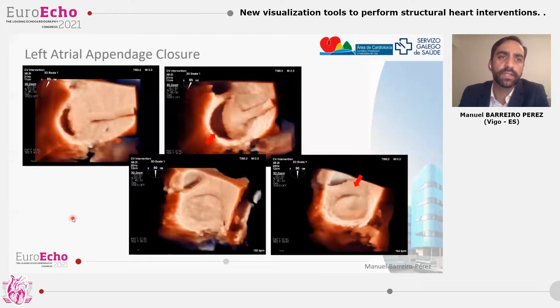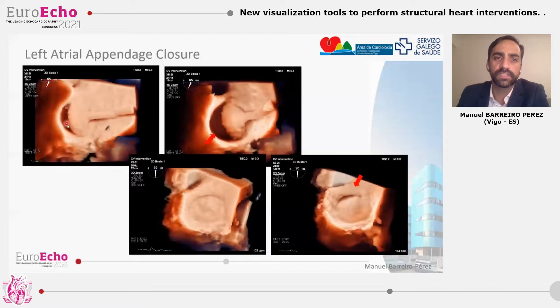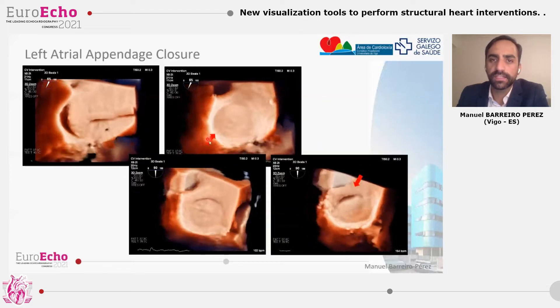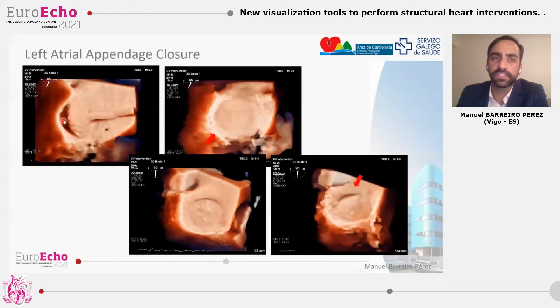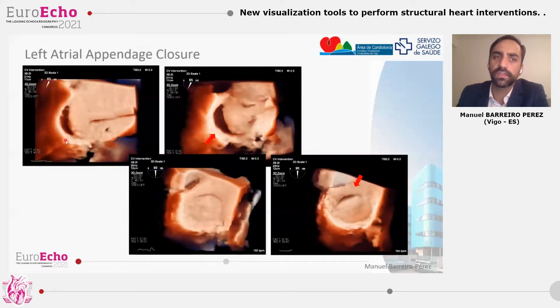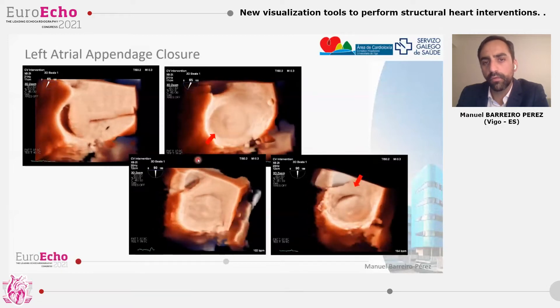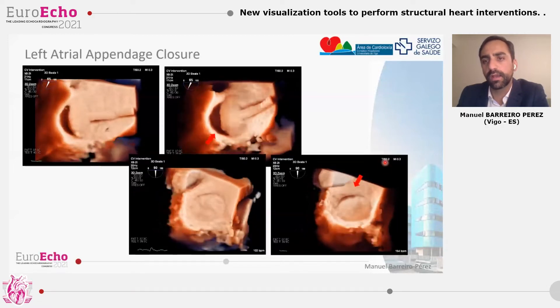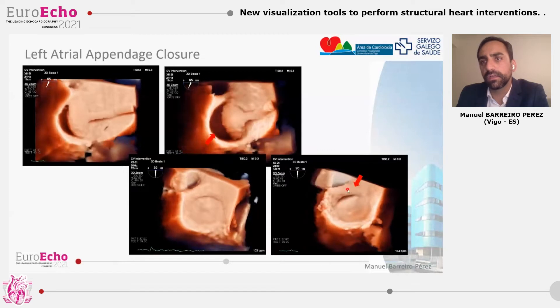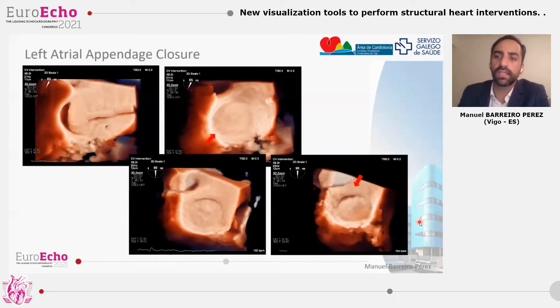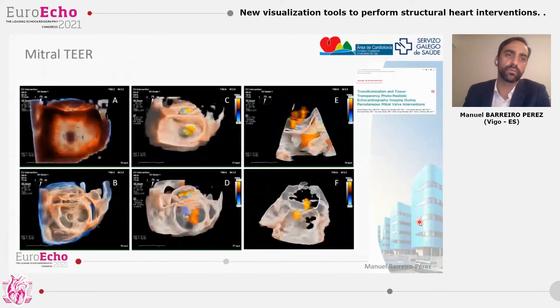In the left atrial appendage closure procedure, moving the light, we can study with the creation of shadows whether the device is completely in contact with the left atrial tissue, or if there is any area of leakage or tension not completely in contact with the tissue. Here in this image, moving the light from this position to an upper position, we can see there is a shadow revealing an area uncovered in the upper aspect of this left atrial appendage that should be surveilled during follow-up to exclude any clot or thrombus formation.